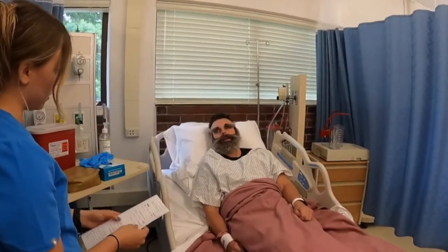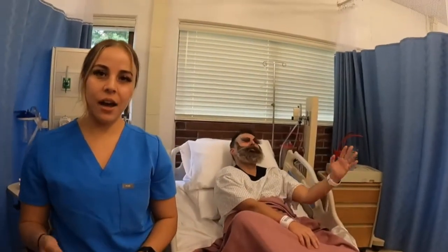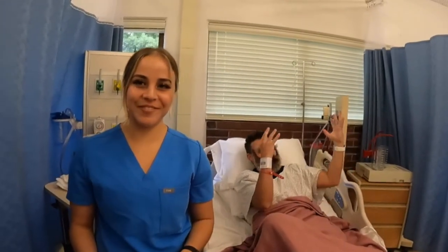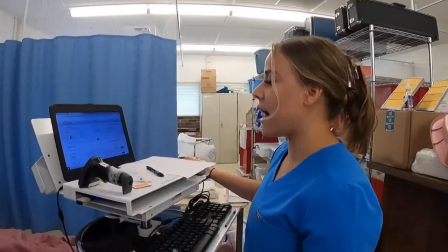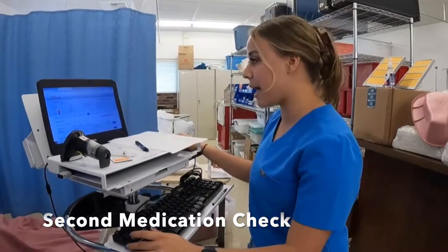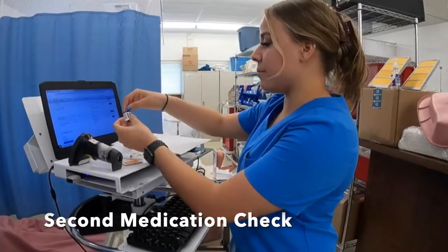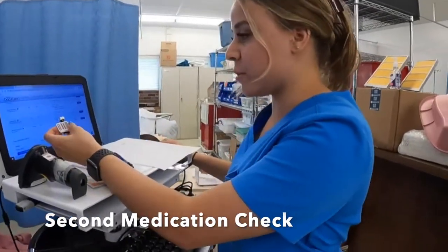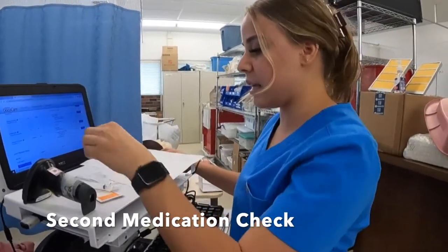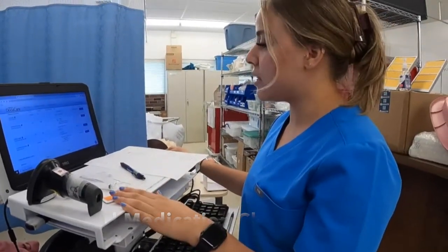Would you still like to take this medication? Yes, please. Moving on to my second check: here I've verified the right patient, which is Morgan Ward, date of birth 6/17/XX. We are verifying the medication, which is morphine sulfate, 2 milligrams per 2 mLs, as it says on the medication vial as well as on the eMAR. It's intramuscular injection and it's due at 1400.